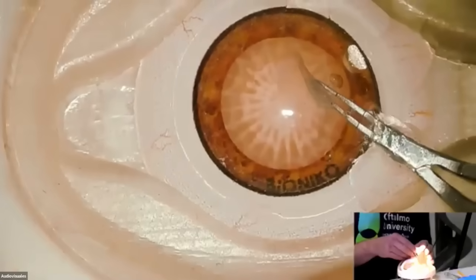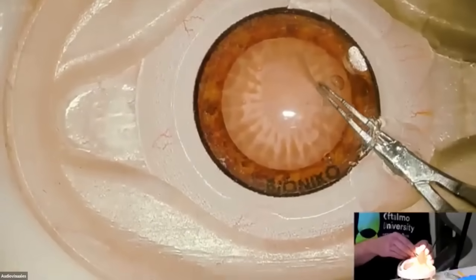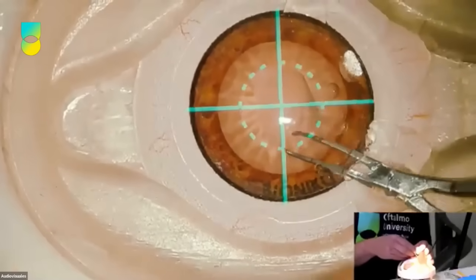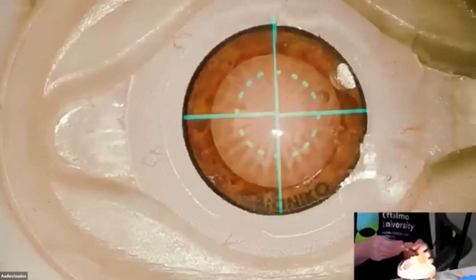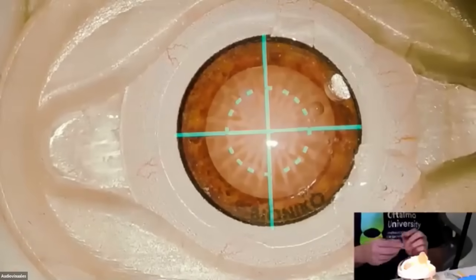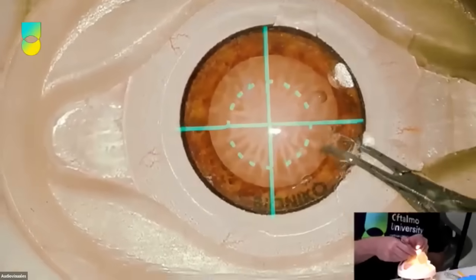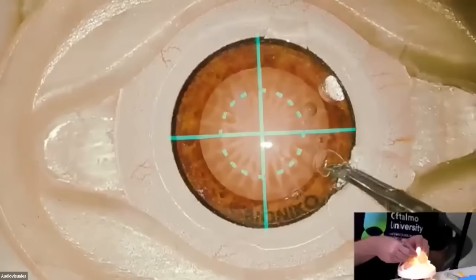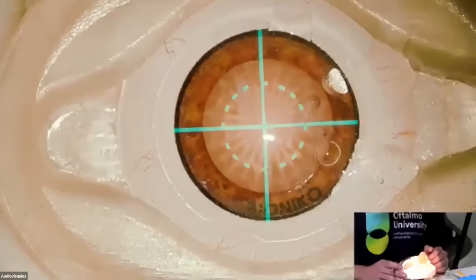Excellent, excellent. So Pablo is doing the Capsulorhexis. Look at that beauty. And one point is that you have to learn to do it clockwise and counterclockwise, because sometimes you start a Rhexis, you are in the middle of it, and you have problems, and you have to take the other end and start again in the other way. So as a resident, you have to train yourself in both directions. That's very good advice.